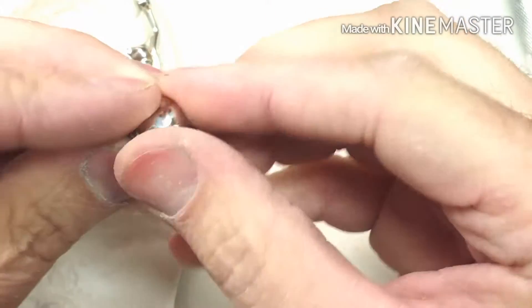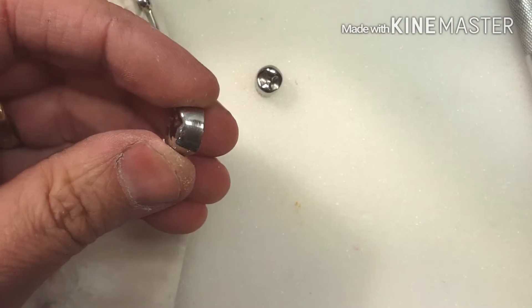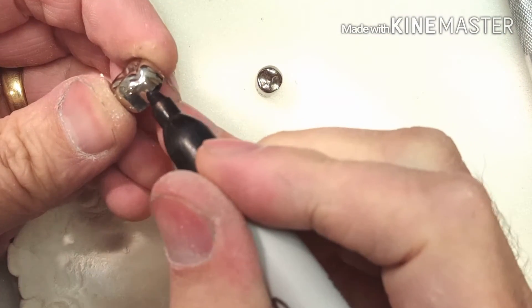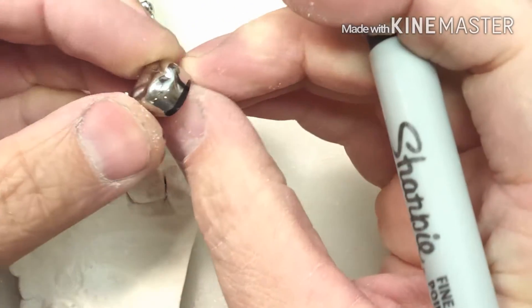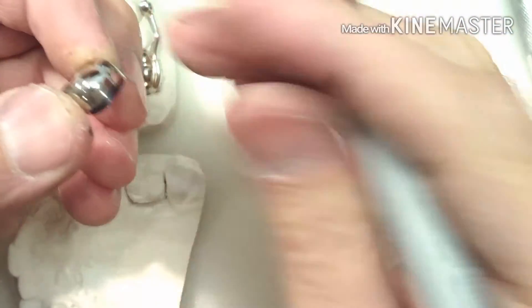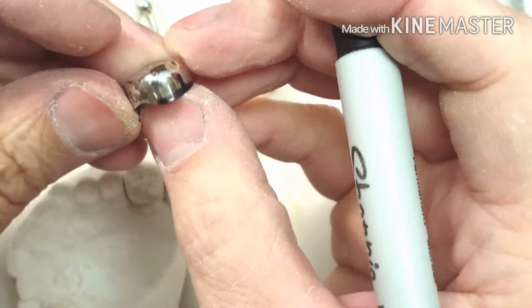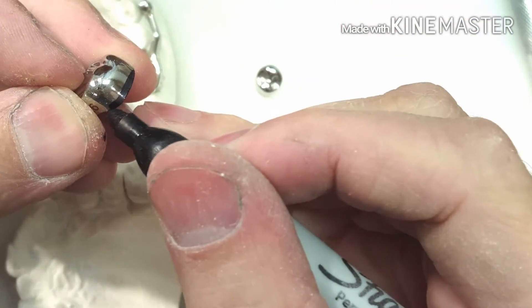I'll show you that portion I'm going to remove — I'm going to mark it in black so you can see. I'm going to take that piece off right there because that's the impinging part. These crowns have a nice curve on the mesial side of the tooth right here, so I don't have to go really any further.